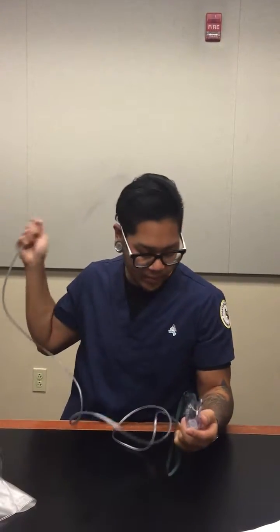I'm going to show you how to put this on too. You plug this into the wall, into the oxygen or the air. Then you just put it over your head and over your ears. If it's not tight enough, you can tighten it right here.